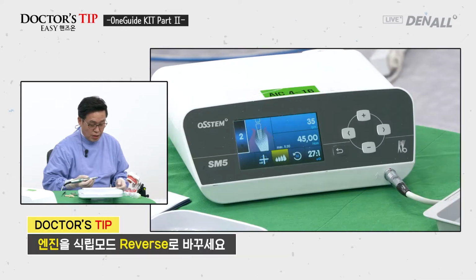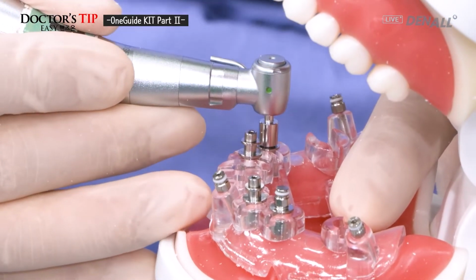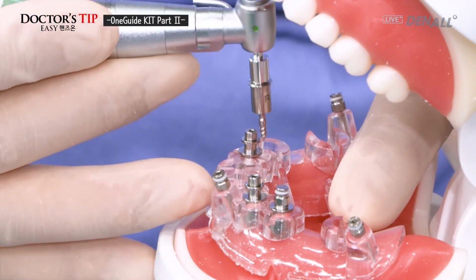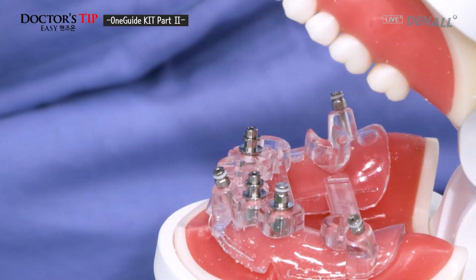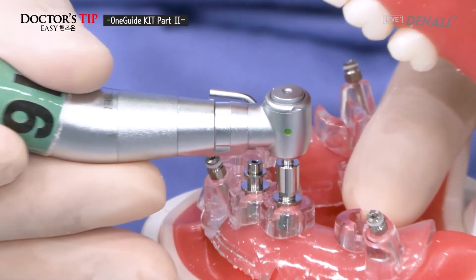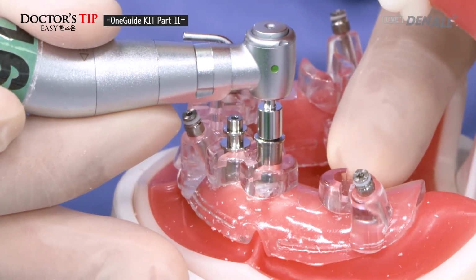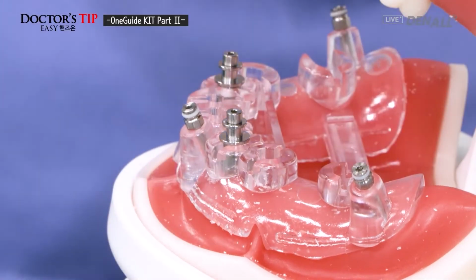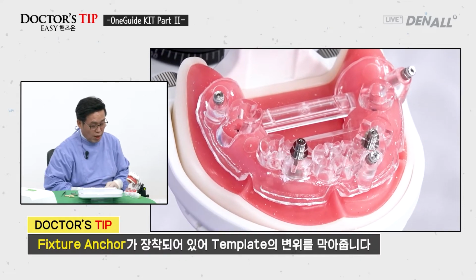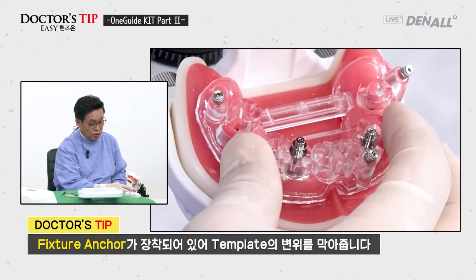I'm going to do reverse on the placement mode, and on number 4, vertical anchor is going to be removed. As shown, number 44 vertical anchor is removed, and number 34 vertical anchor is also removed. Vertical anchor on both sides have been removed, but on number 3, 2 implants have been placed and fixture anchor is connected, so the stent does not move.